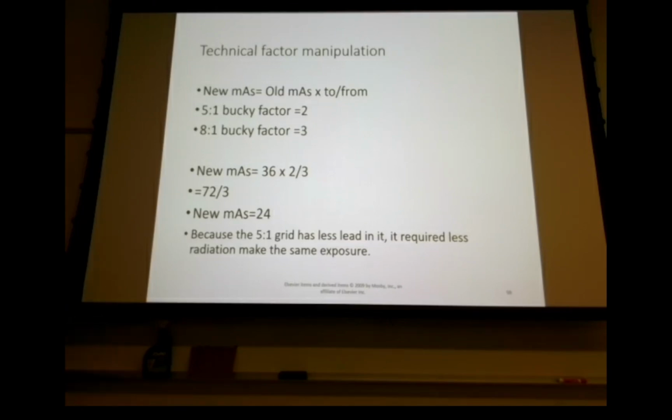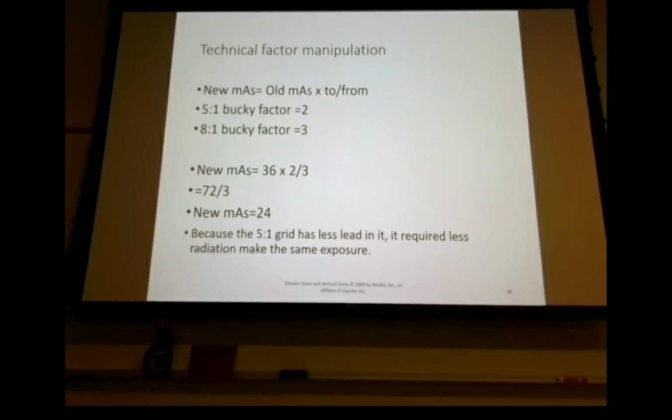Okay? So there's one other thing that we need to talk about, and that is virtual grids. So virtual grids, where is virtual grid? It's on page 305. So virtual grids, I think eventually physical grids will go away when we use virtual grids almost exclusively.